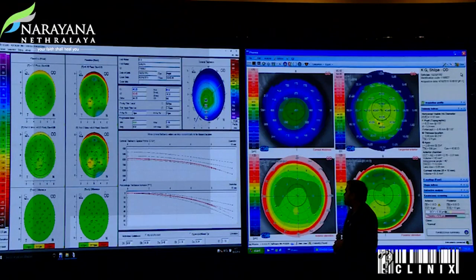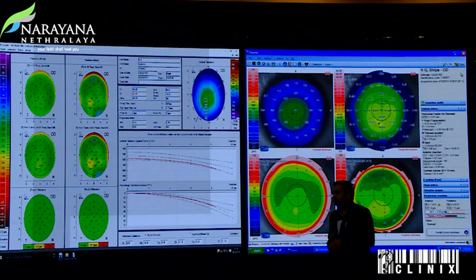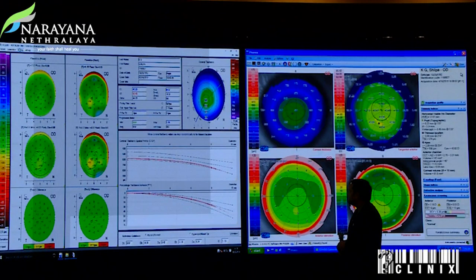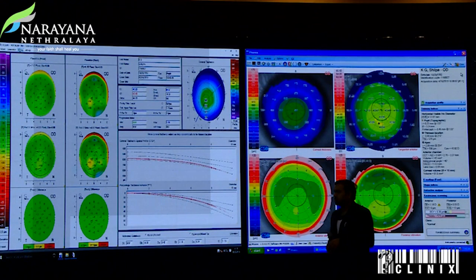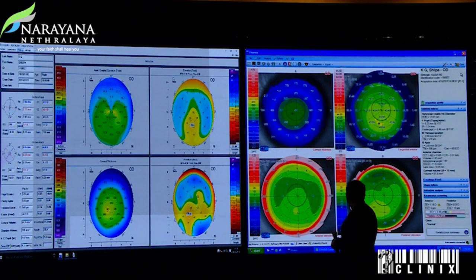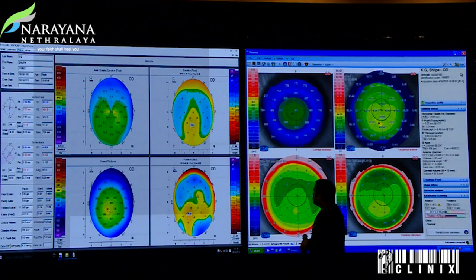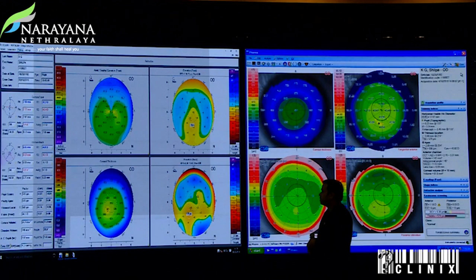One of the things we did when we designed the BAD-D display is we fixed the colors and the scales. So without having to look at the numbers, it is very quick to assess these maps visually. The elevation maps in Pentacam use the Orbiscan scales, and you can see a totally different appearance when using different scales and colors. If you're using different scales and different colors, you really have to pay attention to the numbers, which is time consuming.